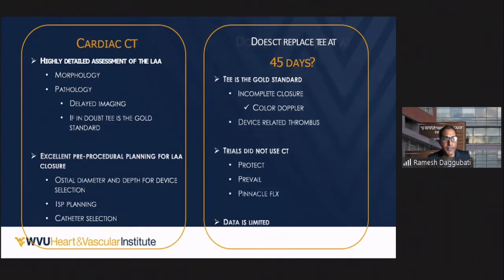Whether at 45 days the CT replaces TEE, maybe, we don't know. But the trials did not use CT in PROTECT, PREVAIL, or PINNACLE Flex, all the ones that we had so far. So the data on CTs is still limited, and it is probably going to be looked at more closely in the future. Right now, we were following patients with CTs, as I mentioned, due to problems in COVID. But now that COVID testing is not required at our center for TEEs, we are going back to TEE assessment.